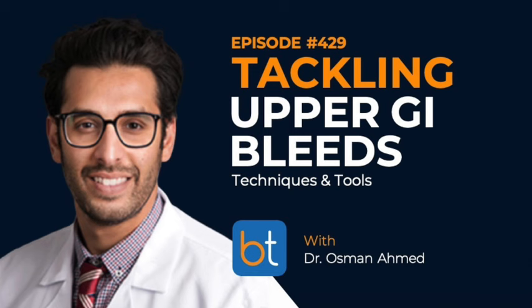Yeah, me either. Some people are like, oh yeah, we do even for traumas. I'm like, really? Okay. But they have to be set up for it. It's got to be part of your routine, part of your tech routine, part of the workflow. So it can't be inefficient in these kinds of situations, right? Exactly. I think where radialists will advocate for the limited adoption with radial access actually is for those reasons. Like you said, staff is unfamiliar with it. The operator's unfamiliar with the setup and the way you're looking at the screen and all that sort of stuff. And obviously in an emergent situation, those aren't things that you want to be worried about.